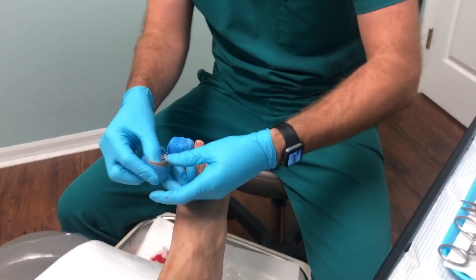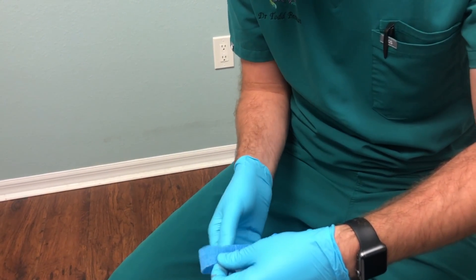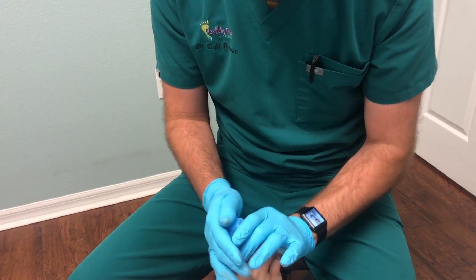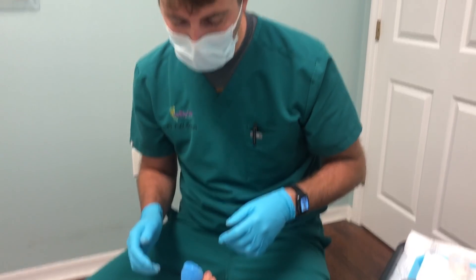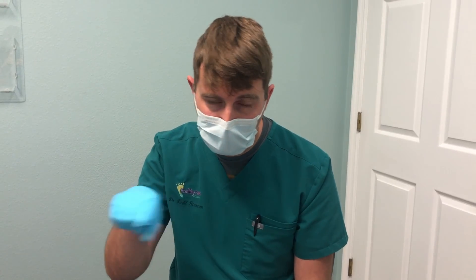All right, we're just wrapping you up. She'll have a blue toe for a little bit — like a Smurf. She'll come back next week, we'll take the stitches out early enough so they don't get embedded in the nail bed. Should we do a follow-up video next week? Everybody wants to see it, so we'll do a follow-up so everybody can see how it looks and hopefully we'll have the pathology result by then.